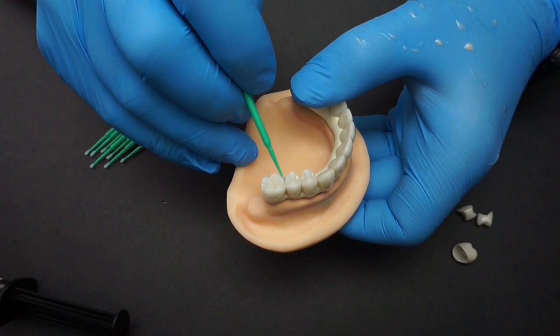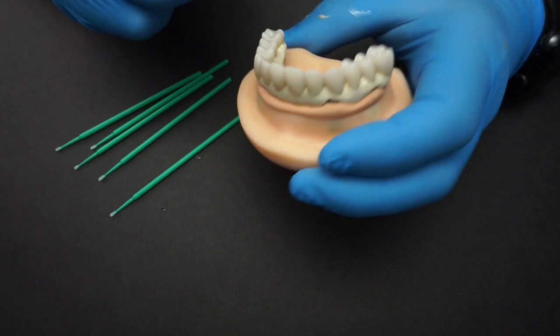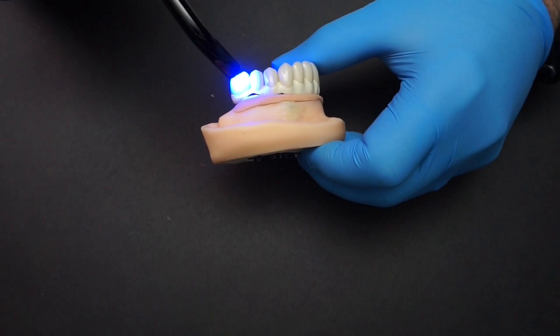Since I'm doing a single arch I'm able to just press the teeth in place. If you're doing something with an opposing arch, you probably want to do this in an articulator. Since this is a dual cure cement, after you've placed all the crowns go ahead and activate the cement with a light cure unit. You don't necessarily have to do that, but it does help and will start the chain reaction for the entire cementation. The alternative is to let it sit for about 10 minutes for the whole cementation to take place.